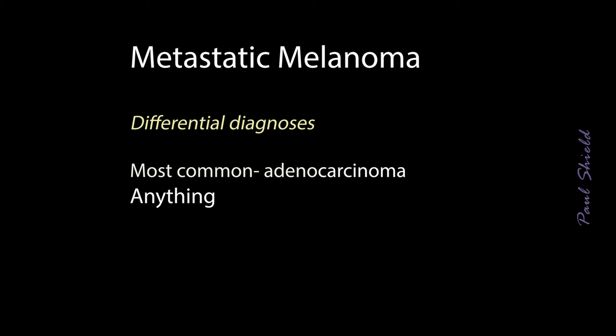So sometimes adenocarcinoma will appear very similar to that plasmacytoid case I just showed you, with a more dispersed population. They will have cells that are, again, plasmacytoid, so an eccentric nucleus. They'll also have prominent single central nucleoli, just like melanomas, and it can be quite a difficult differential. Obviously, to confirm adenocarcinoma, we'd be looking hard to find cohesive, truly cohesive groups, and probably vacuolation in the cytoplasm. But as I say, the differential can be very wide and will usually require immunohistochemistry to prove the diagnosis.